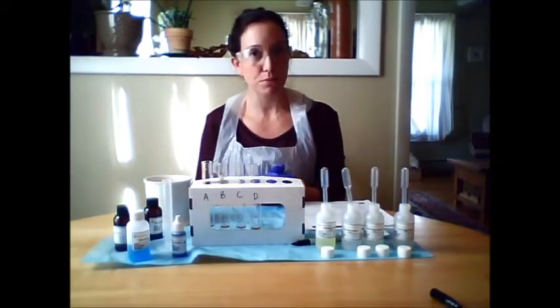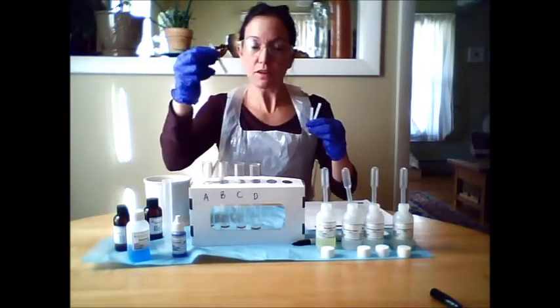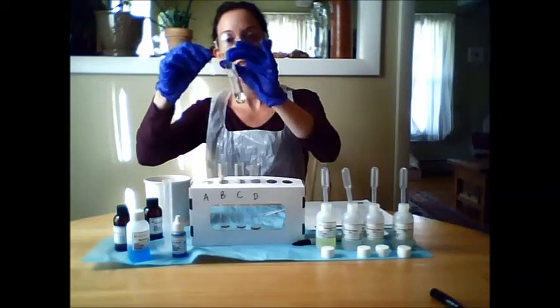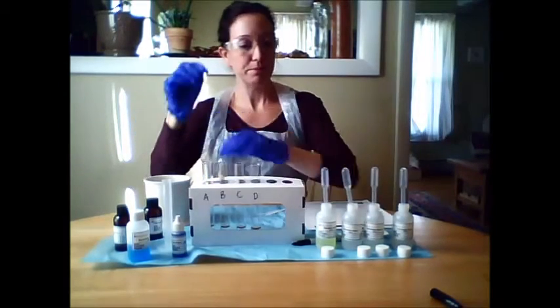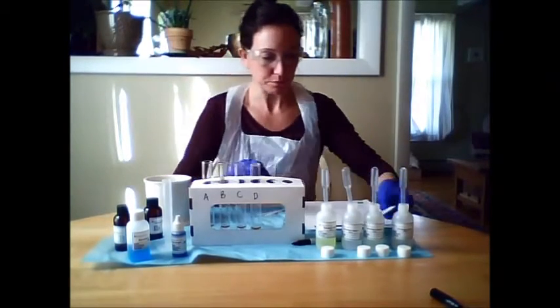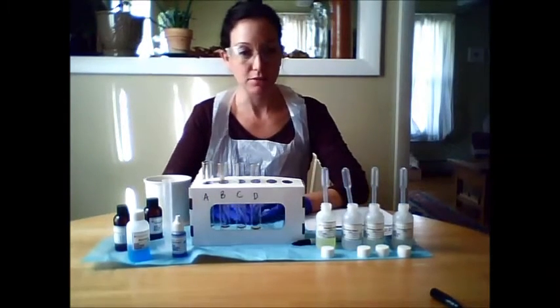In the first part of the experiment, you will be testing the pH of this simulated urine using the pH test strips. This is a very simple procedure where you will insert the test strip into the urine for 30 seconds. You may have to tilt it. Just be careful not to spill it. And then you will match the color change to what's on your pH indicator. You'll record that in the table in your lab handout.